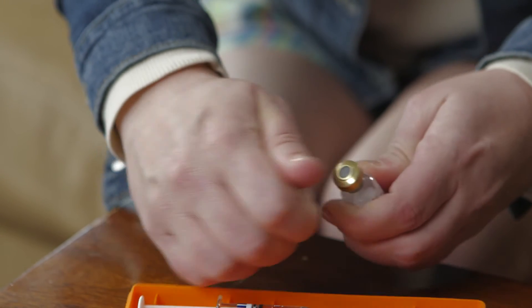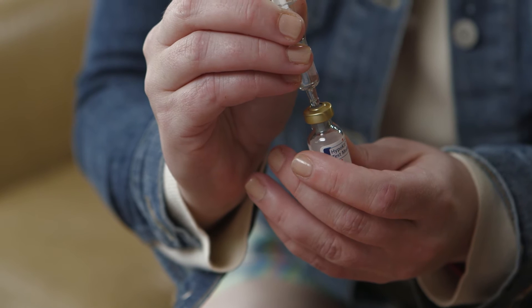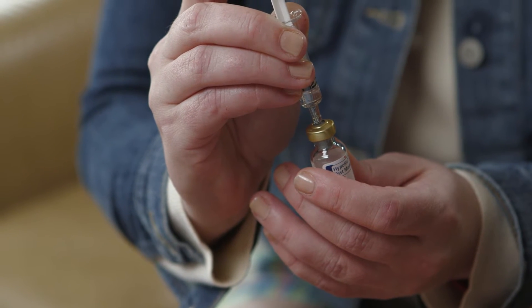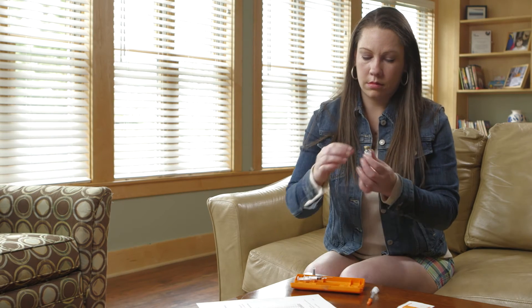Remove the cap from the vial of glucagon. Remove the needle protector from the syringe. Inject all of the liquid into the vial of glucagon. Remove the syringe and gently swirl the vial to mix the solution.